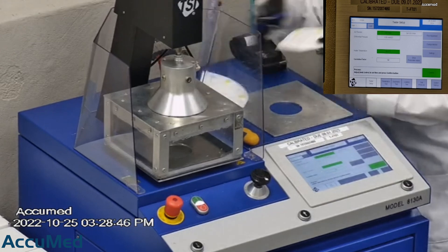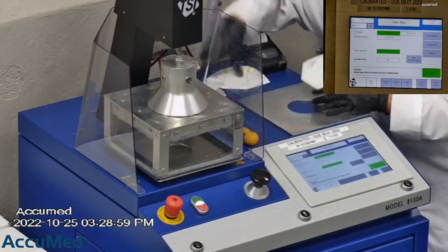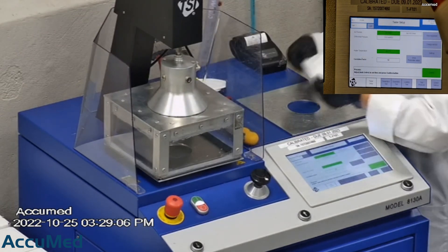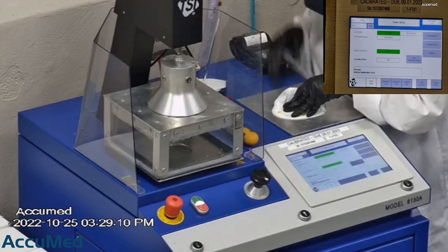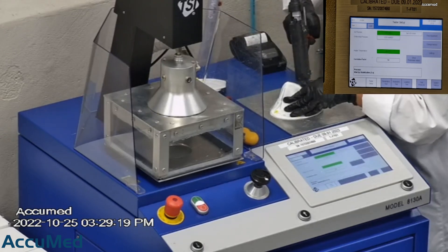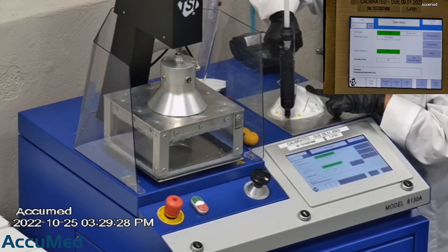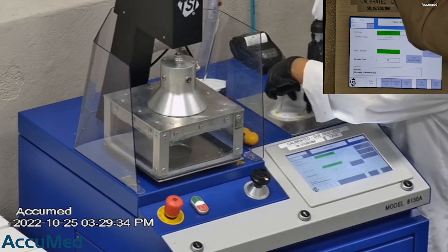Then we make sure that the mask is properly and completely sealed with hot glue to the testing plate. When applying the hot melt glue, we make sure that there are no holes or leakage around the seal to ensure accurate results. The testing plate is then attached to the frame and the box is placed under the TSI filter holder for testing. The results are displayed on the TSI monitor.